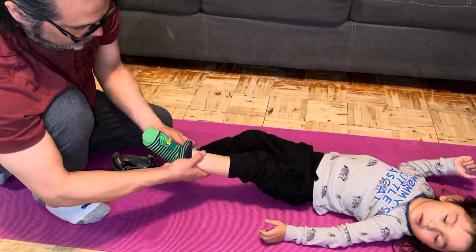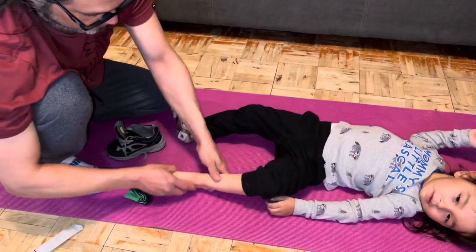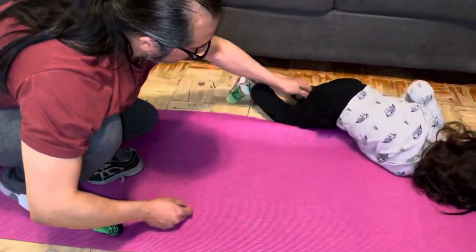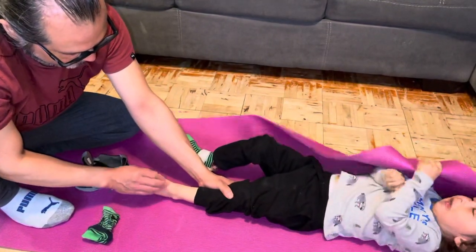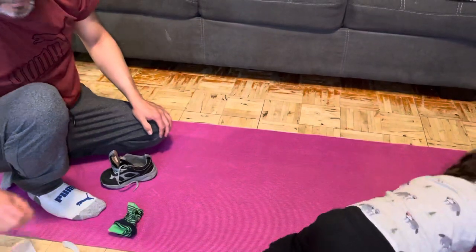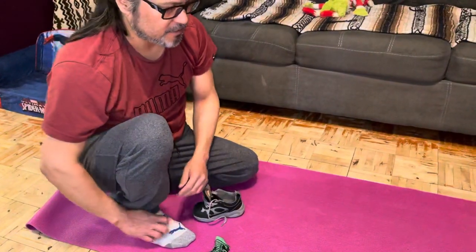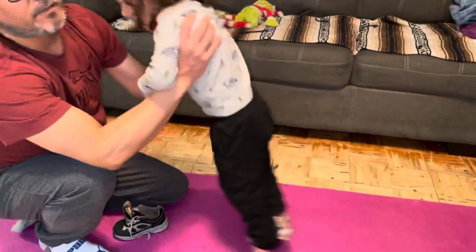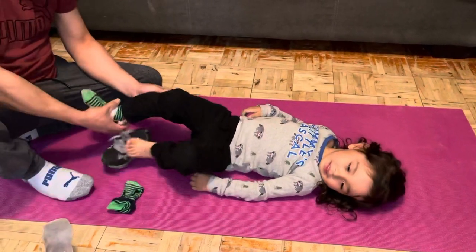The only thing to watch out for sometimes is redness. You'll see a little bit of redness here — that's why we got them adjusted. The redness around his foot is normal and should go away in about 20 minutes or so. If it's not going away in 20 minutes, it might have been too tight, so just have it a little bit looser. You're not tying up skates — you just need it so his foot's not moving around in it. That's everything.